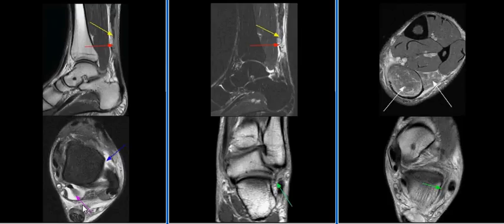Fluid is seen in the flexor hallucis longus tendon sheath, which is disproportionate to the tibiotalar joint effusion, consistent with tenosynovitis of the flexor hallucis longus.